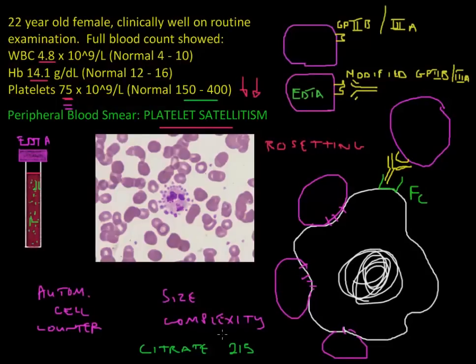For all practical purposes, when you see a patient with a low platelet count and the peripheral blood smear report shows platelet satellitism, you must repeat the count on a different anticoagulant like citrate to get a true value before starting any investigations that may be costly or dangerous to your patient.